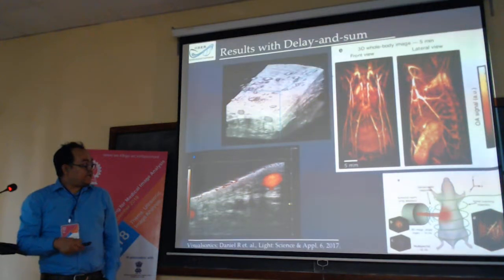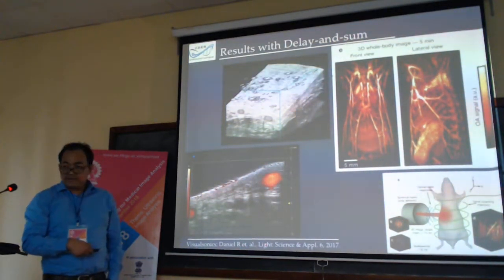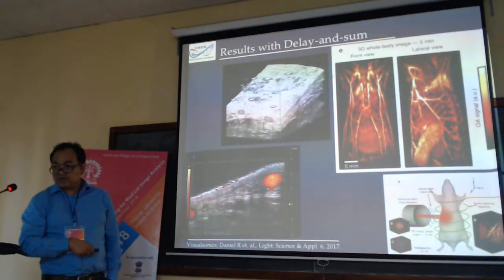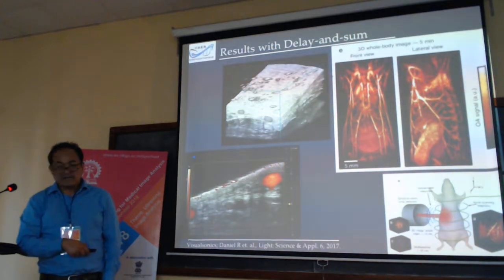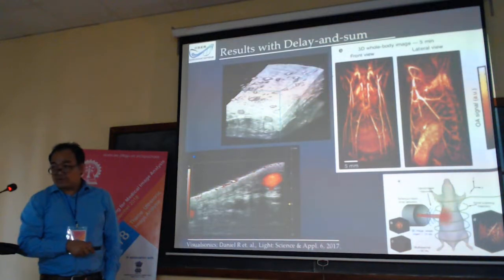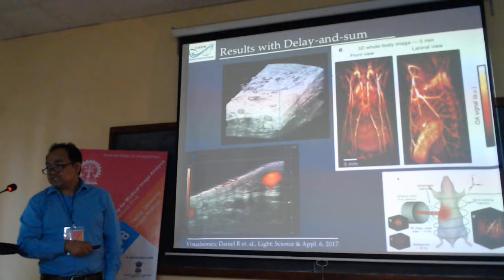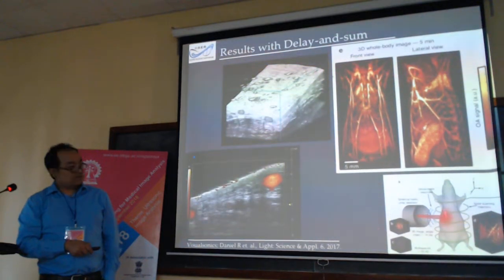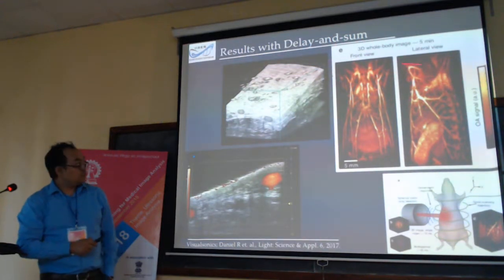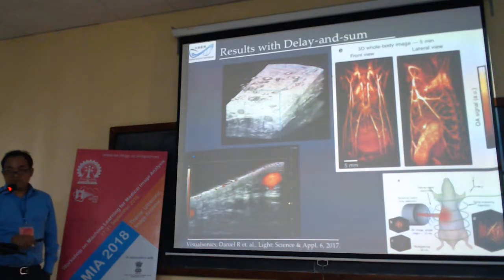Very interesting is that this kind of imaging system is reported by Razansky. I think he is from the Technical University of Munich. Now he is moving to Sweden, I think. So he can achieve 60 micrometers with this tomography technique. So tomography is now reaching the microscopy region.